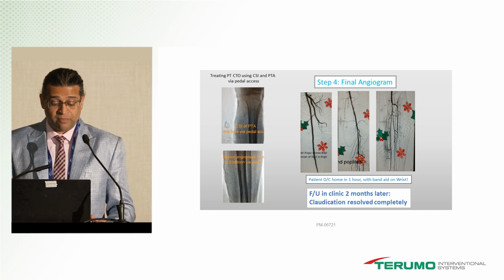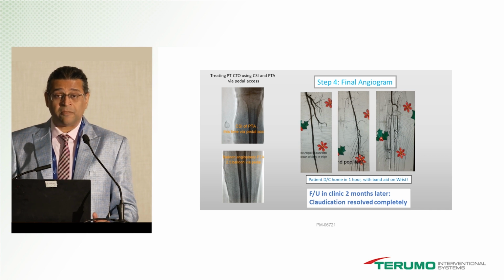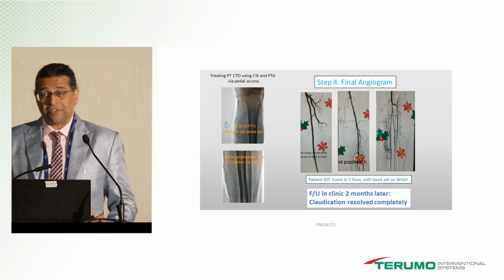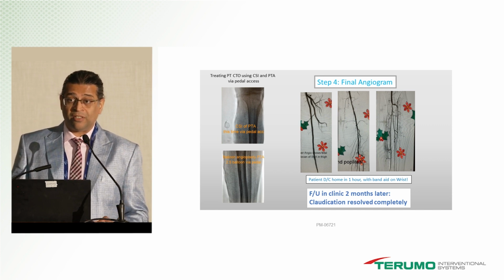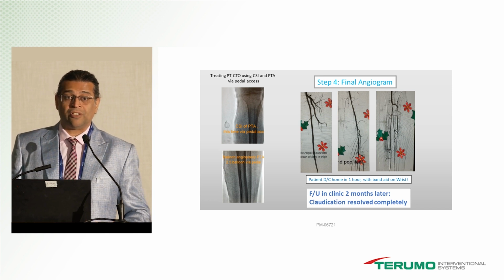So I treated on the way out with a balloon and got pretty good angiograms. Patient did well. And remember that this is going to be very relevant because this patient had a lot of heparin, right? For a 3-hour procedure, they get 10, 12,000 units of heparin. You're always worried about closure now, right? Closure is so important. You can do a great case for 4 hours and you can just screw it up because your closure has not been good.